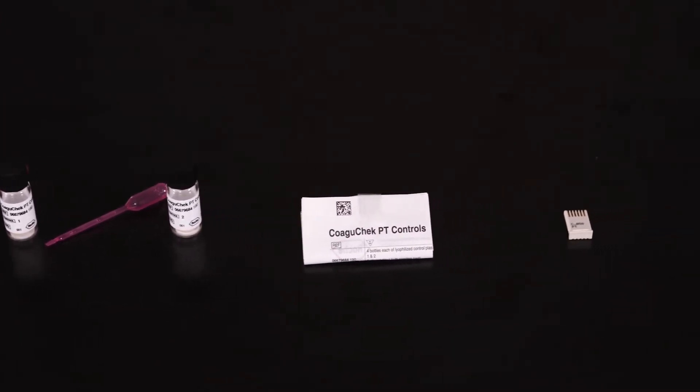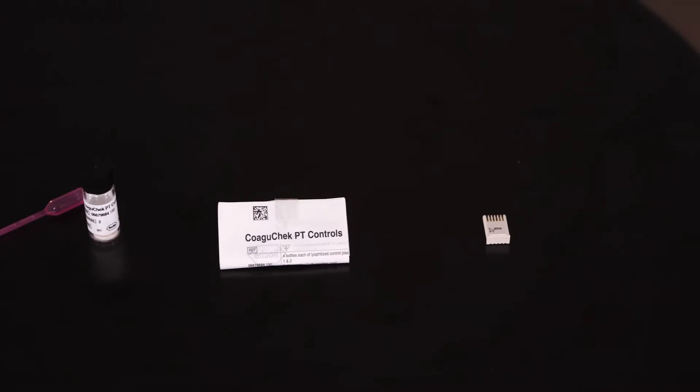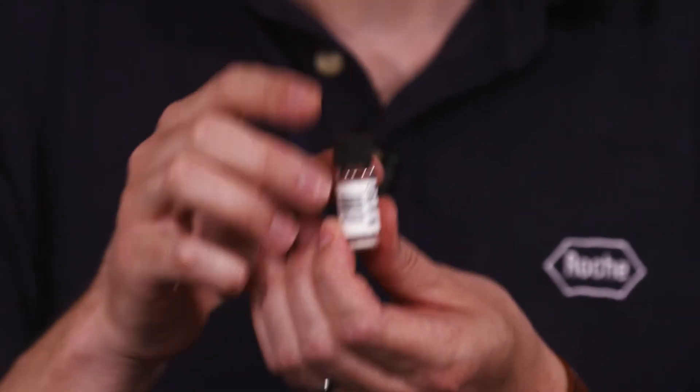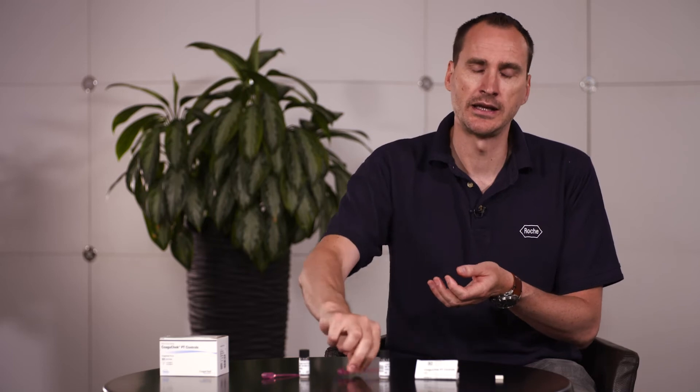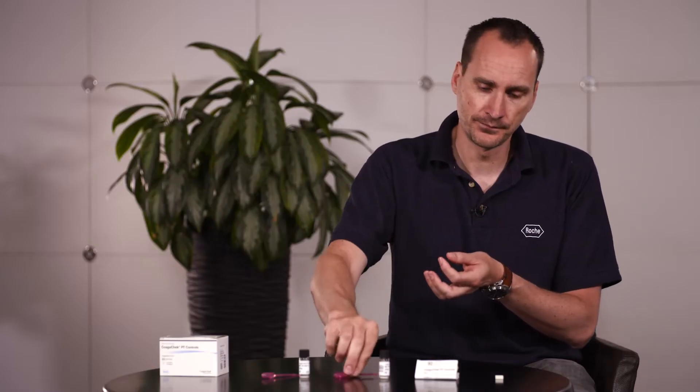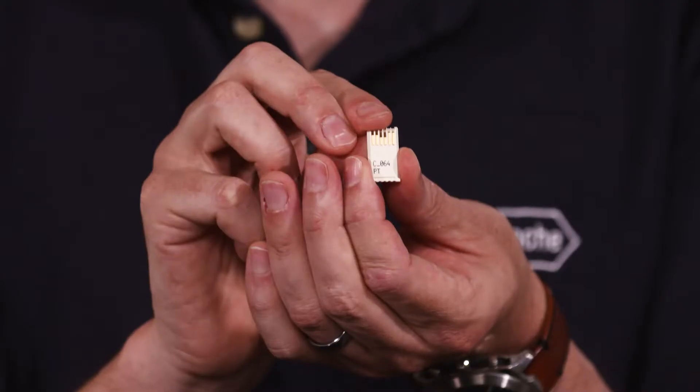Inside the box of quality control you will receive four ampules of level one, four ampules of level two, eight sealed pipettes, and a pack insert. Please ensure you thoroughly read the pack insert, and a unique code chip that matches the lot number of the quality control.